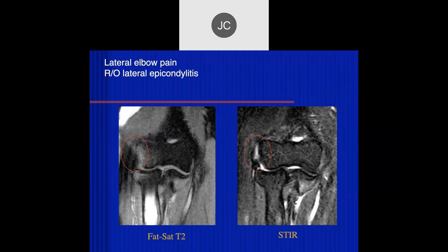In another area we have loss of signal intensity within the muscle - this is where water is giving us the signal, and its frequency is changing so that water is resonating where the computer thinks fat should be. We're getting inadvertent water saturation here. This in-between area masks the underlying pathology. You'll see this all the time in elbow and wrist images - at the margins you'll have failure of fat suppression. Usually you ignore that, but you often have to think twice to make sure the artifact isn't suppressing a partial tear of the common extensor tendon.